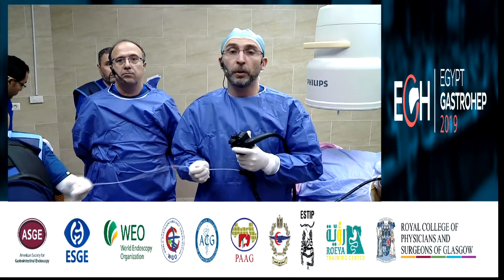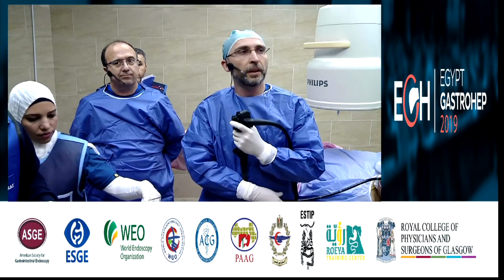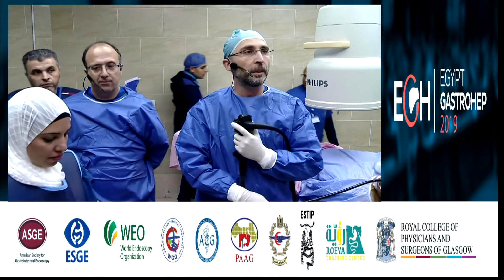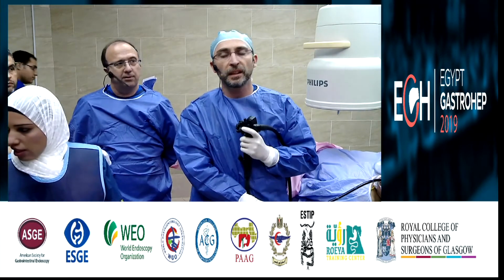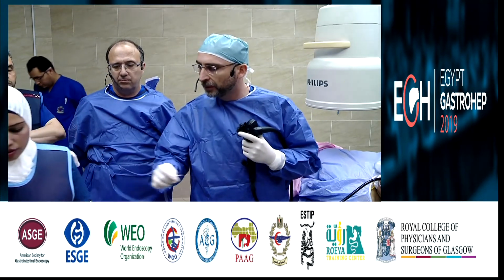Okay. Hello everybody. Hello, I'm here with Professor Perez Miranda, Jimen, Emin, the anesthesiologist, and all the team. I'm using the Pentax duodenoscope. This is the case that you just saw, a young lady that had cholecystectomy. Can you put the terumo wire inside, please?